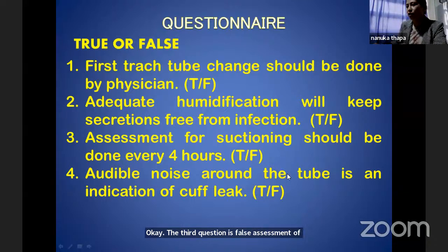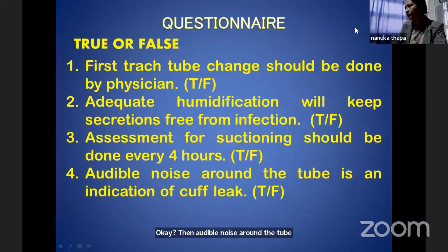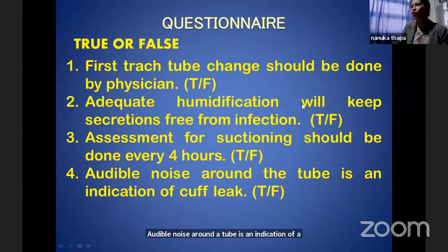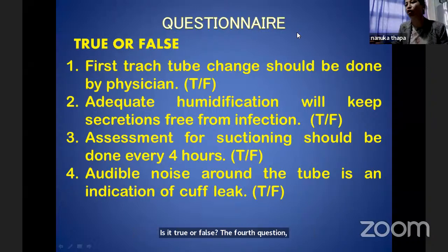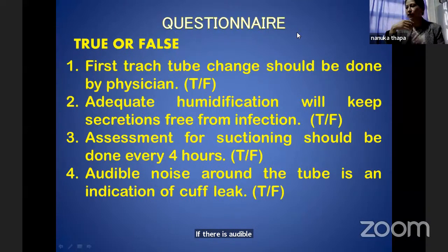Then the fourth question: audible noise around the tube is an indication of a cuff leak. Is it true or false? Yes, it is true. If there is audible noise around the tube, it means there is a cuff leak.